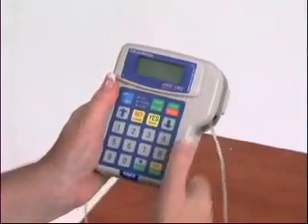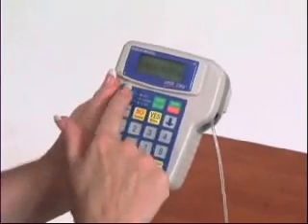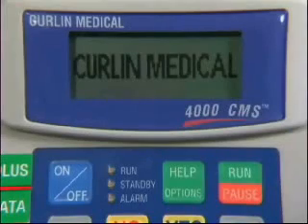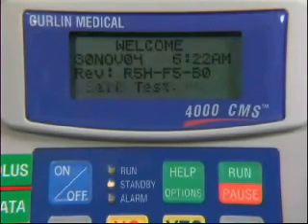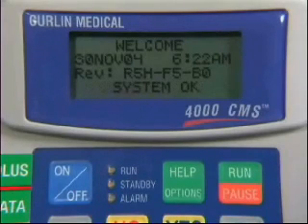Turn on the pump by pressing the on-off button in the upper left corner. The Curlin logo and pump name will be displayed in sequence. Then the pump will go through a self-test sequence. You will see the small LEDs beside the on-off button labeled run, standby, and alarm. The LEDs will flash green, yellow, and red in that order.